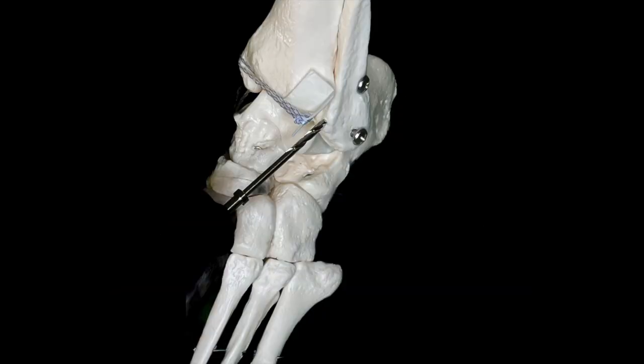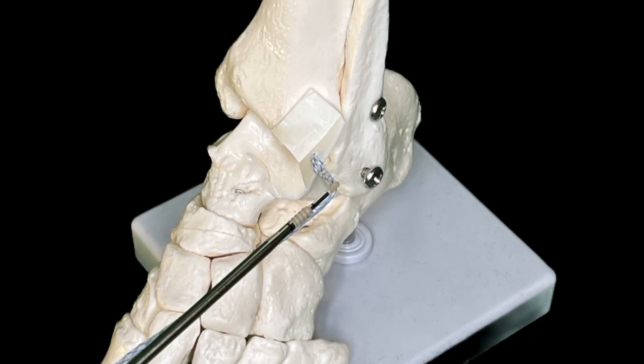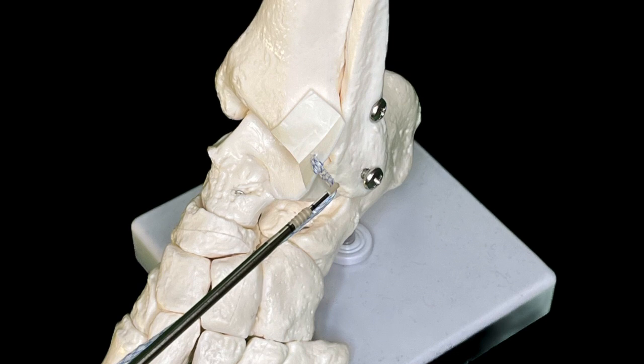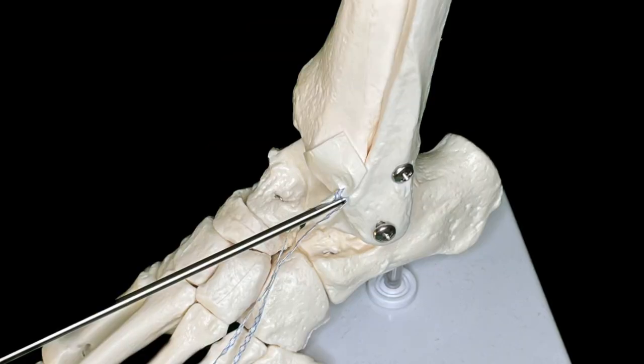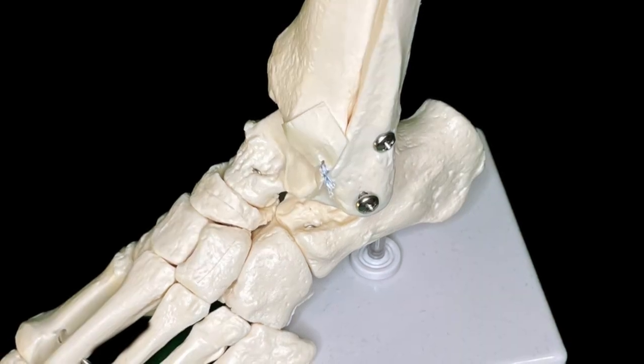The fibular bone socket is made with a 2.9 mm drill. The suture tape is pulled through the 2.9 mm pushlock short eyelet and the anchor is introduced into the bone socket. The inserter handle is lightly malleted until the laser line is flush to the bone and the thread tails are cut.